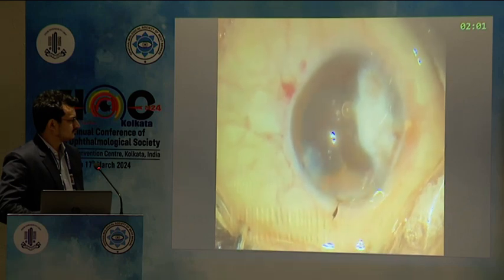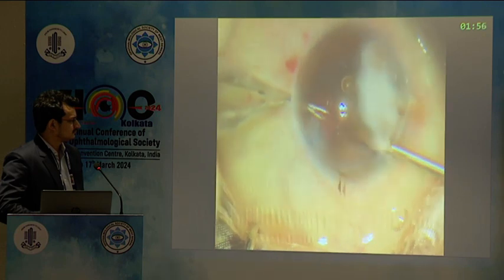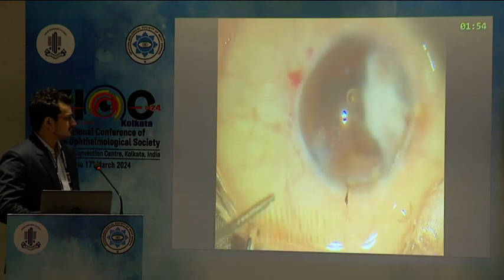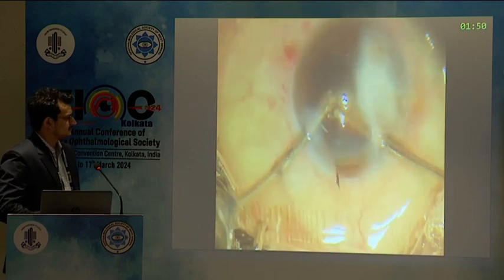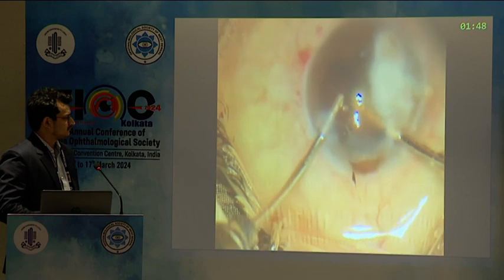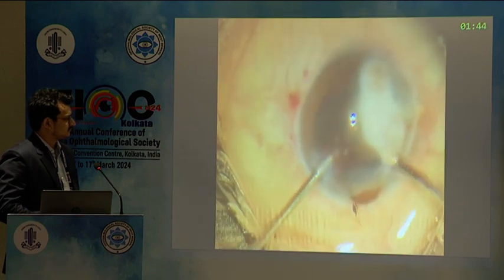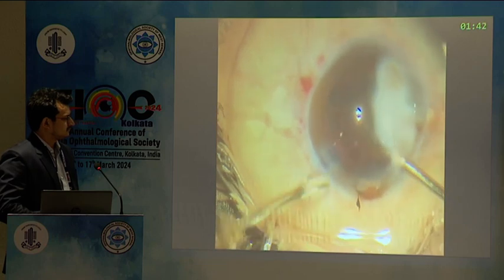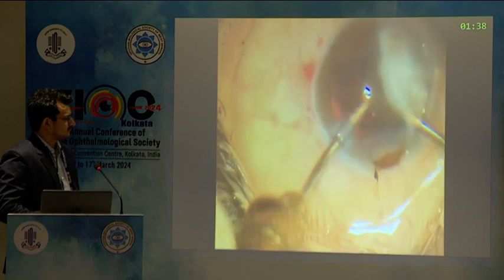The bag is then inflated using viscoelastics, and cortical aspiration again became difficult in the portion which lies underneath the corneal opacity area. Swift, gentle movement of the tip needs to be done in order to avoid catching the iris margin and further complicating the surgery.